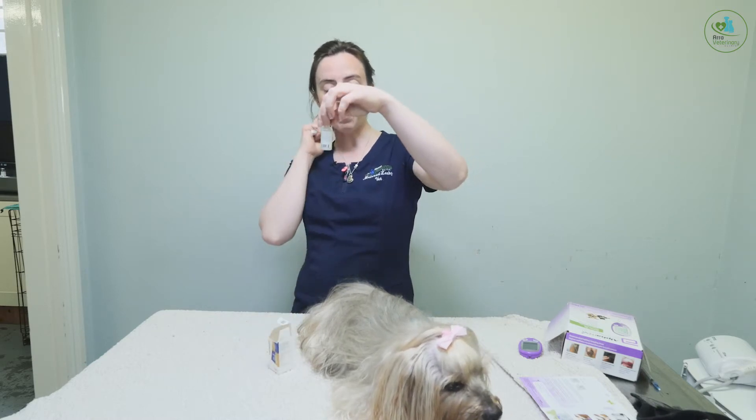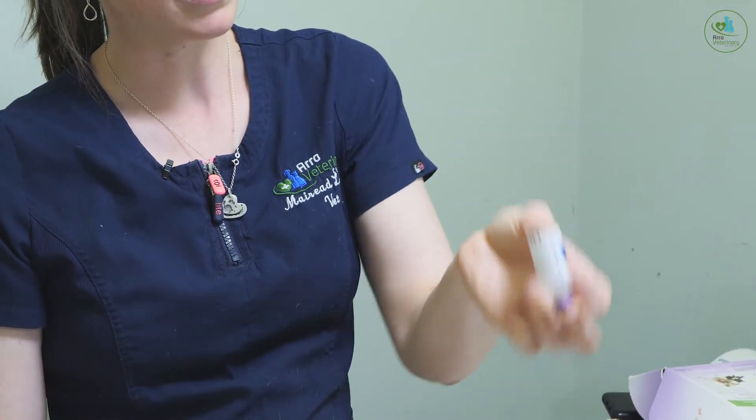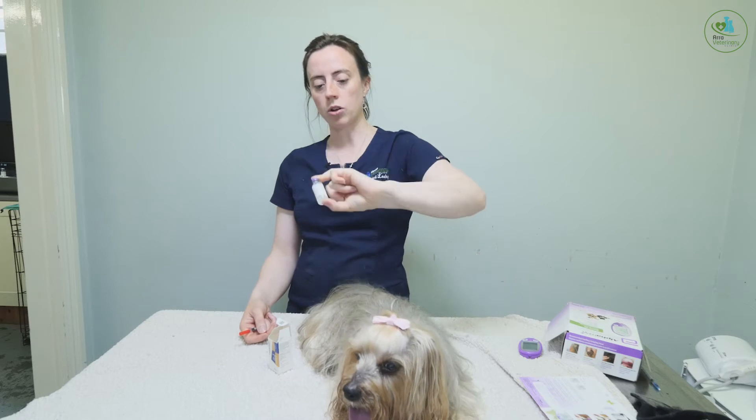When you take your bottle out of the fridge, do not shake it. You invert it slowly — that means turning it upside down really gently like that. This is to make the solution even throughout, but don't shake it because that will cause air bubbles.